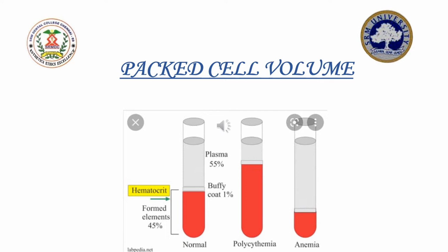Now coming to the anticoagulants, the most preferred and used during estimation of packed cell volume is EDTA. The expansion of EDTA is ethylene diamine tetraacetic acid. Otherwise we can use dry heparin or double oxalates. These are the most preferred anticoagulants.